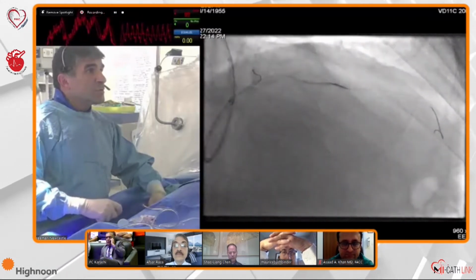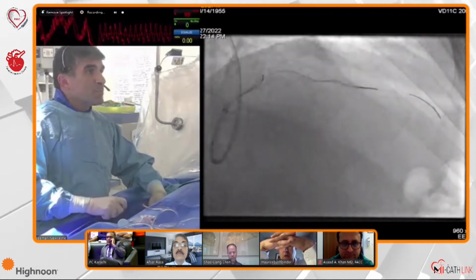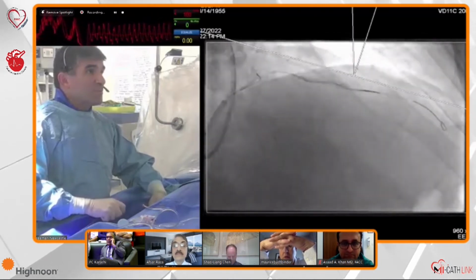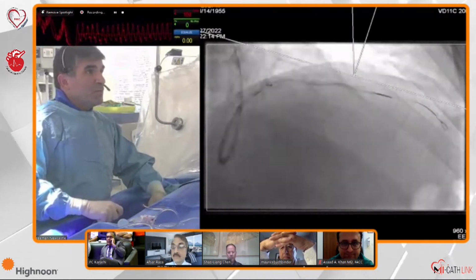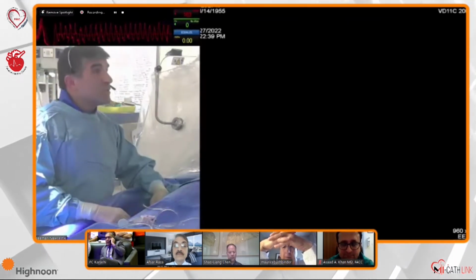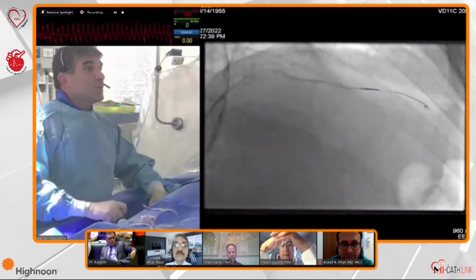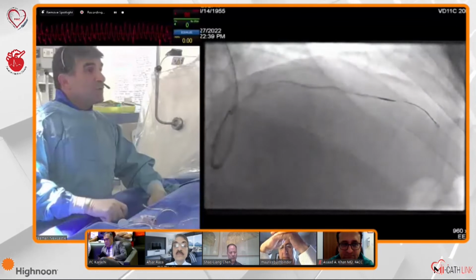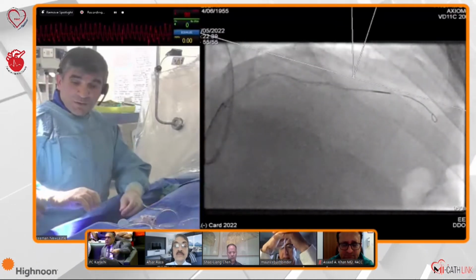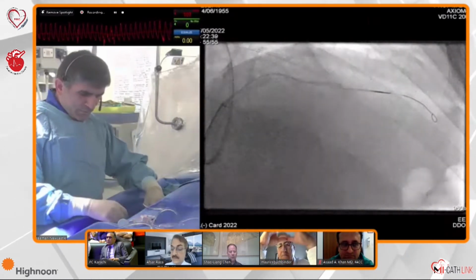Can we move this oxygen tube away, please? Are you going to take the circ out? Yes. I mean, again, this was mentioned. You can use 2 wires, but if there's severe tortuosity and the wire is close to the burr, it's not advisable because you could cut the wire, and this happened to me before. But often you can, and if you are stuck and you don't want to take your wire out, you use a guide liner. However, doing a guide liner will limit you in the size of the burr, and it's really cumbersome with all the gear in.